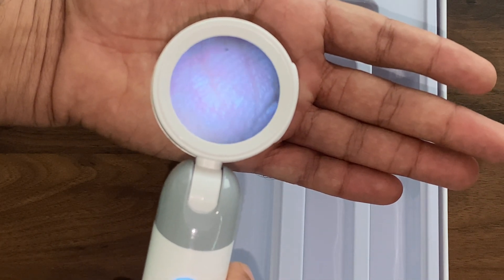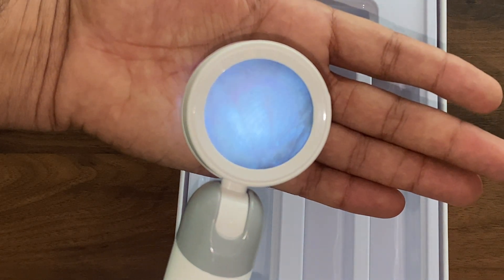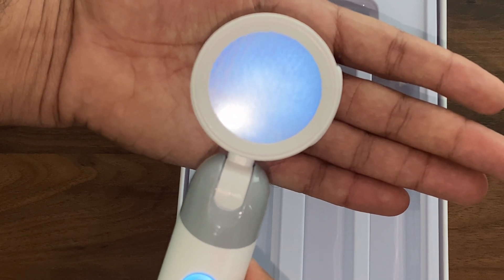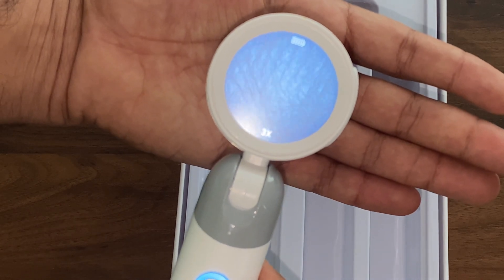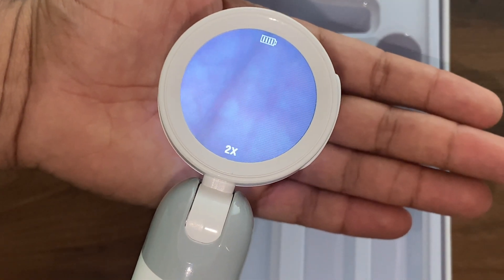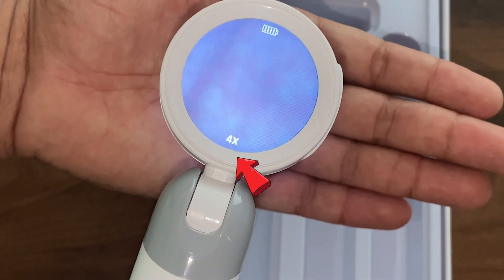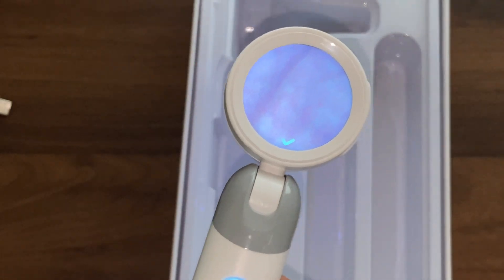You can see the blue light at the signal indicator button. Next to that is the photo button, and next to that is the zoom button. You can see it is now focusing on my hand — you can even see fine skin creases. Whatever you are observing can be zoomed at 2x, 3x, 4x, back to 1x, 2x, 3x, and 4x. This is the still image we get when captured.